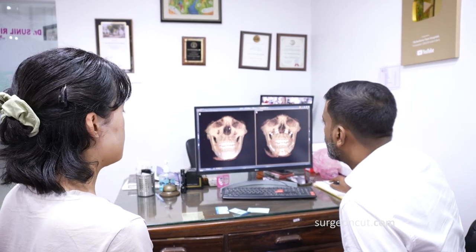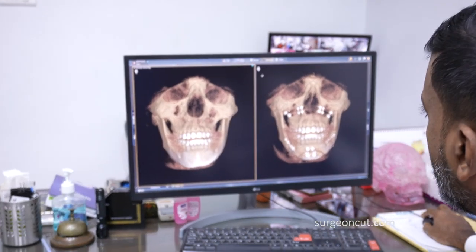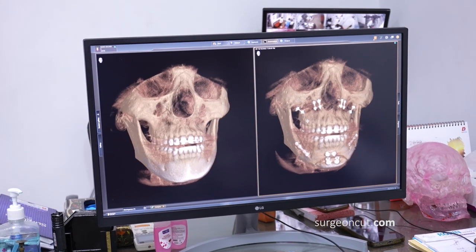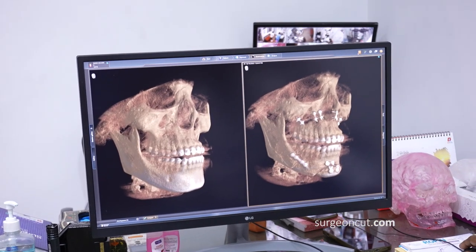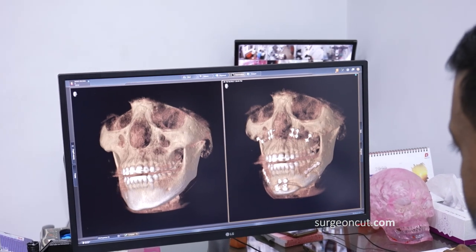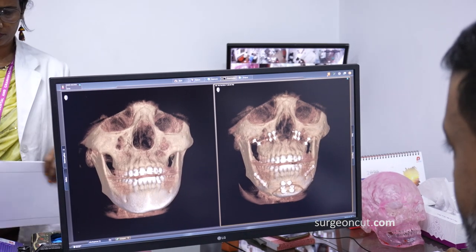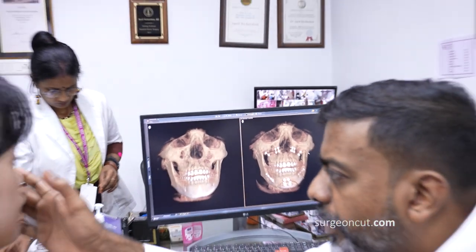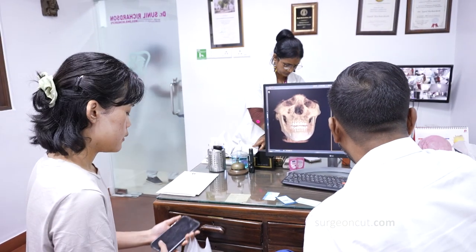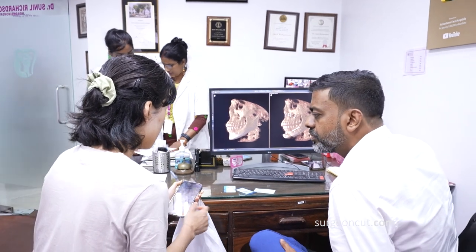See this. This was taken on 10-2-2022. And this was taken on 10-10, 8 days after. If you see here, you have one plate with four screws, one plate with two screws, another plate with four screws, another plate with two screws. So you have four plates and 12 screws on the upper jaw. 4-4-2-2.